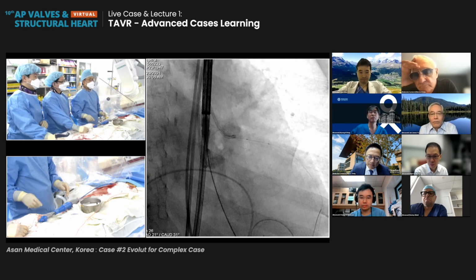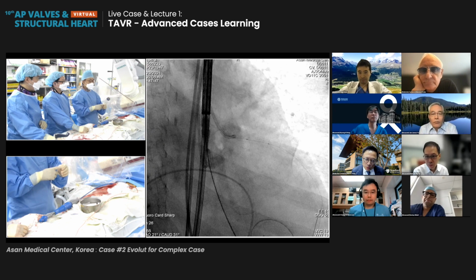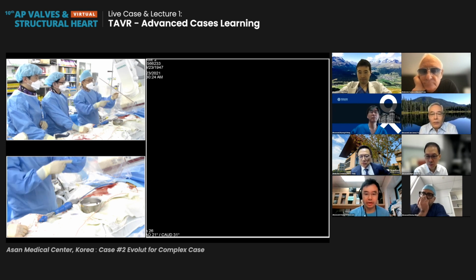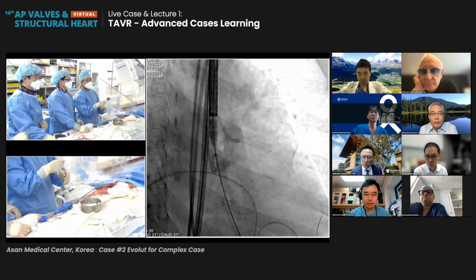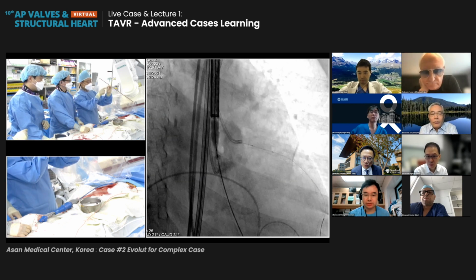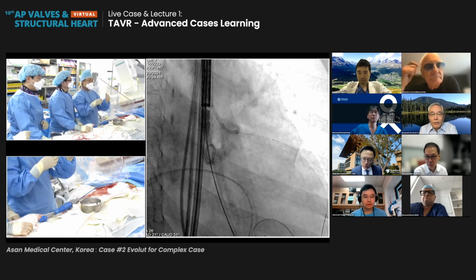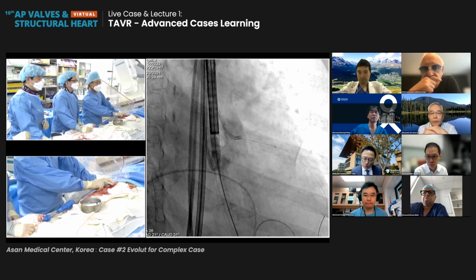Okay, this is the cusp overlap view. As you know, compared to the double S technique view, the tricuspid view, the cusp overlap view is usually more caudal and more RAO. At this point, the pigtail tip was located in the NCC. Usually, if you're going to do the cusp overlap view, we release at the middle part of the pigtail ring. However, in this patient, we're going to do a deeper implantation. We're going to try for the bottom of the pigtail, and release there.